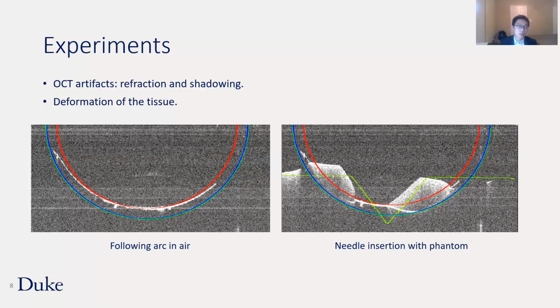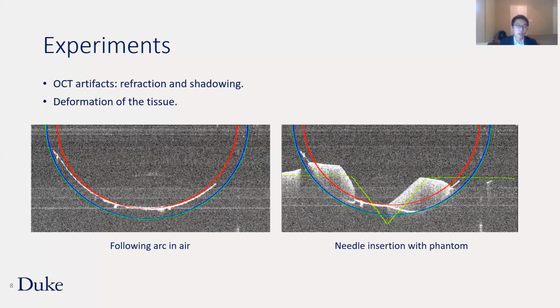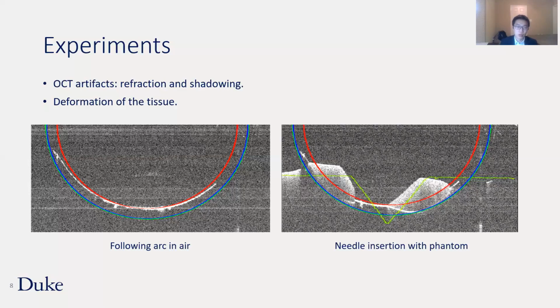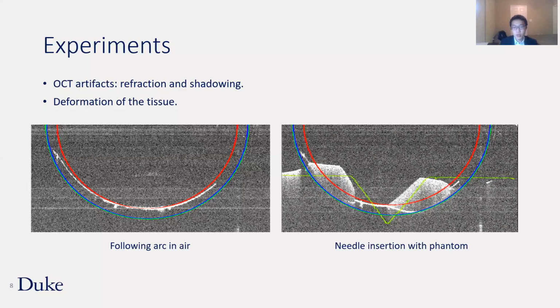Due to these reasons, it is hard for us to implement closed loop control. Instead, we use open loop control. The result shows that the suturing accuracy can still meet our requirements. After the needle insertion, we manually unmount the needle from the robot and pull the needle out. The suture will go through the wound, and the top layer of the wound will approximately go back to its original state.